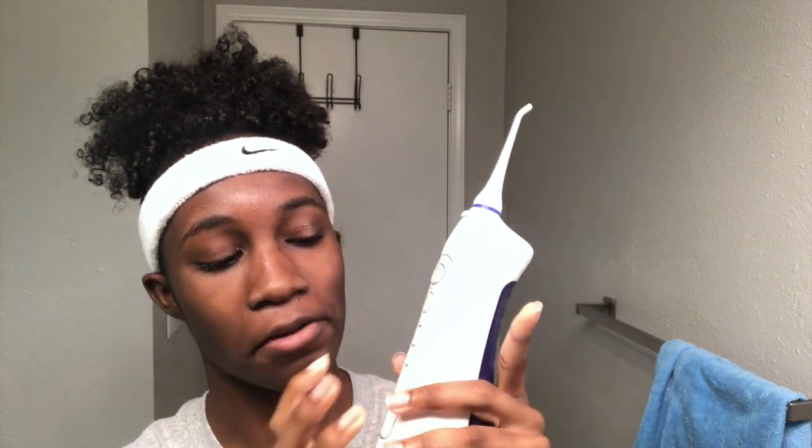There are two ways that you can fill it up: you can fill it up from right here, or you can fill it up by taking the whole reservoir off. I like to do it like that — I think it's easier. It also comes with three different modes: normal, soft, and pulse. My favorite is the pulse.